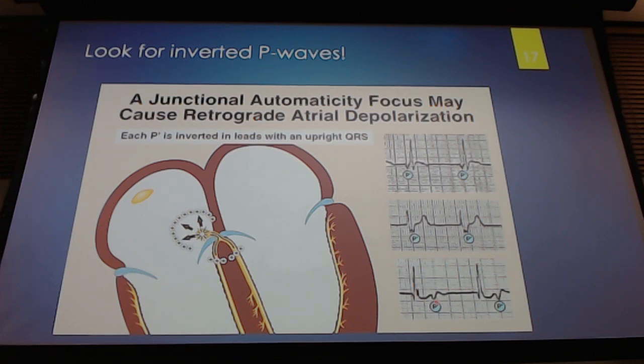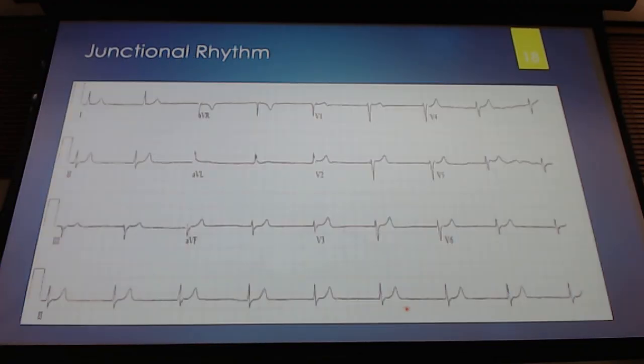Okay? Probably more of the lower AV area. We've got depolarization immediately of the ventricles, but again, we had some of that depolarization that kind of snuck back up into the atria, but not until after those ventricles were identified on the ECG. The top one is going to be more commonly what you see, and the second or third one.